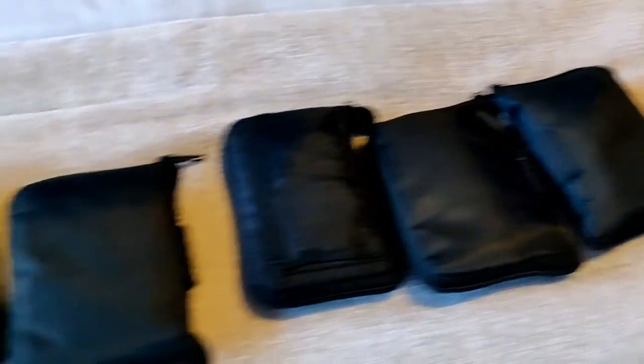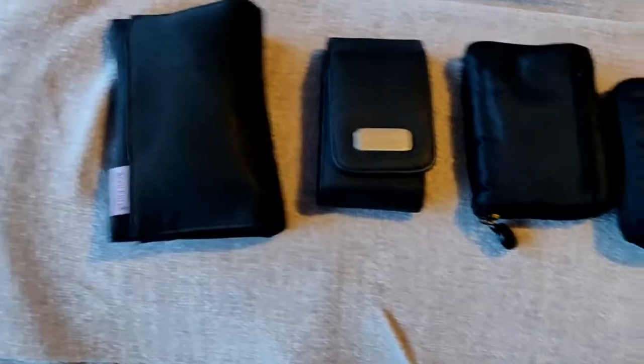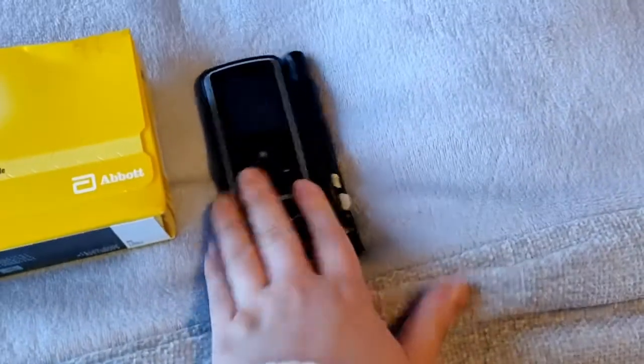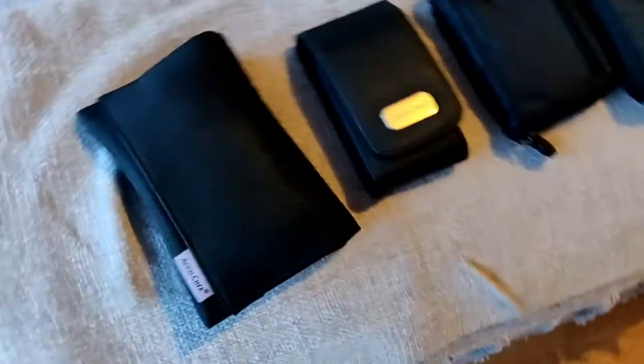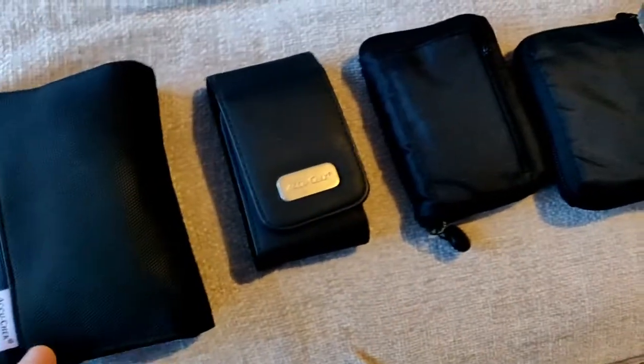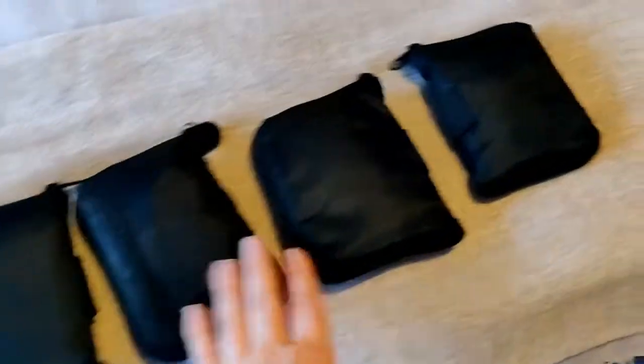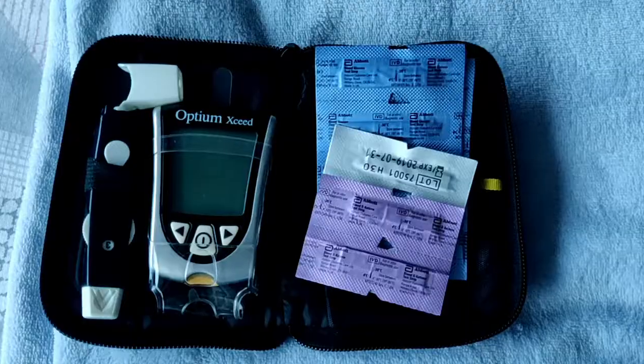I've just taken some stuff out of that box and you can see I have a lot of monitors. There's my Freestyle Libre 2 — I have one on now — and these others are over 13 years' worth of blood sugar monitors. Some of them are the same model but broke or got old and needed replacing, so I have a lot. Let's start off with the oldest one first.